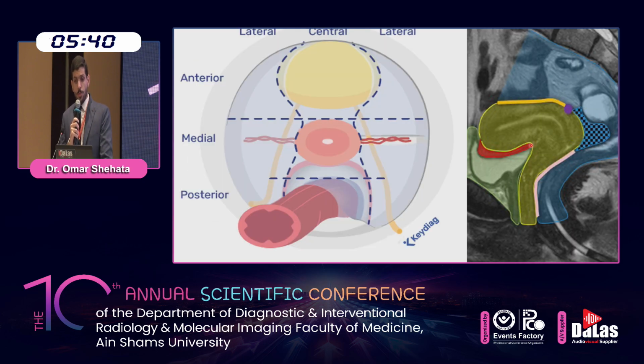It is recommended that when a radiologist evaluates and reports an MRI for endometriosis, the pelvis should be divided into compartments, as previously suggested by different international and national societies.